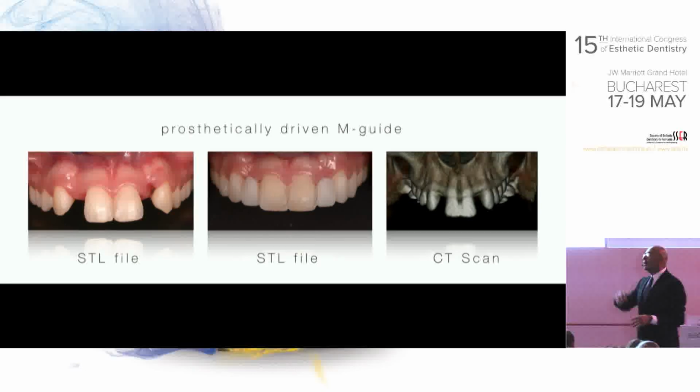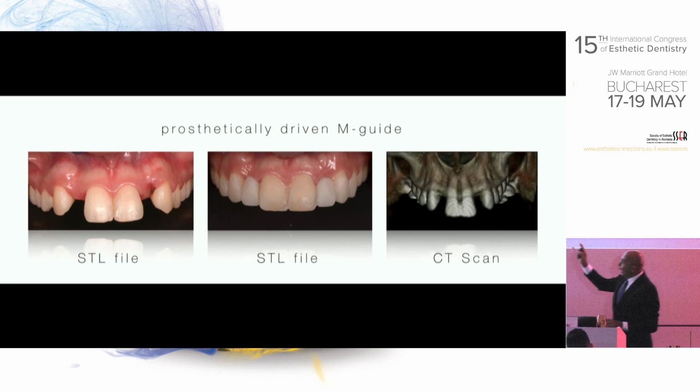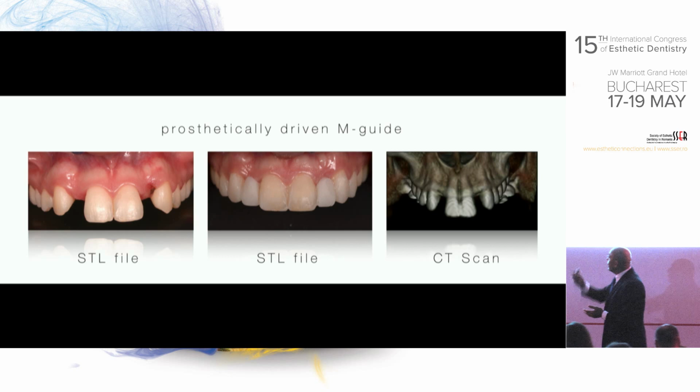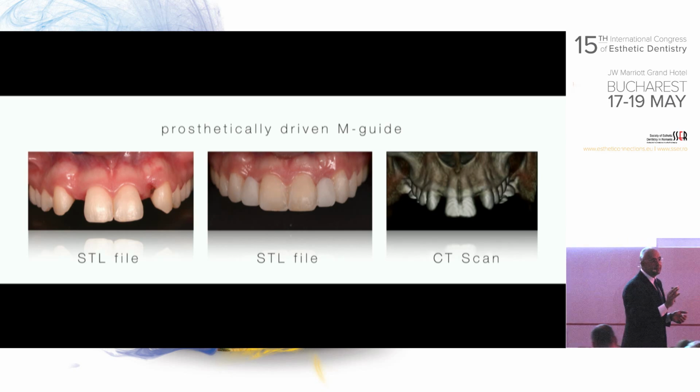I don't care if it's MIS or another brand, but this gives them an extremely precise way to position the implant. And with any brand you want, if you want to have a guide, these are the 3 things you have to provide.